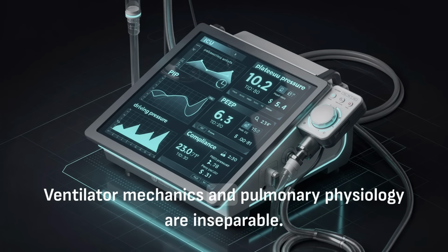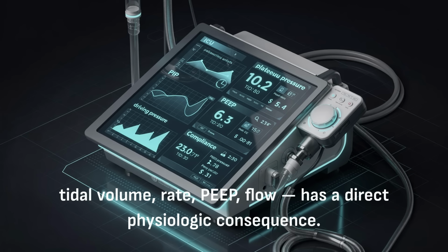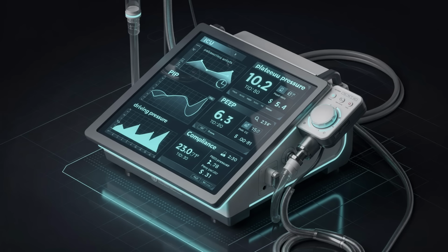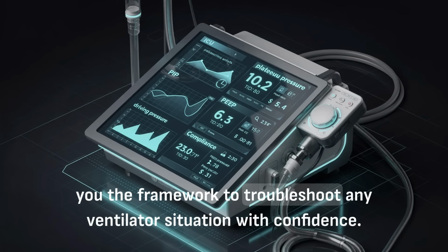Ventilator mechanics and pulmonary physiology are inseparable. Every parameter you set, tidal volume, rate, PEEP, flow, has a direct physiologic consequence. Understanding the pressure relationships, compliance, resistance, and dead space gives you the framework to troubleshoot any ventilator situation with confidence.